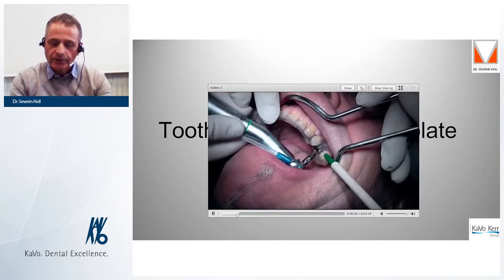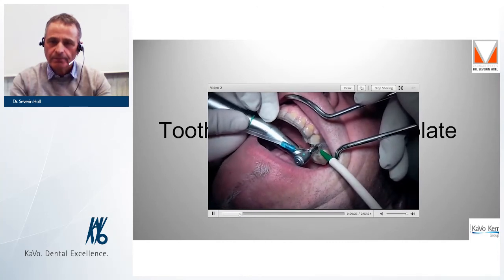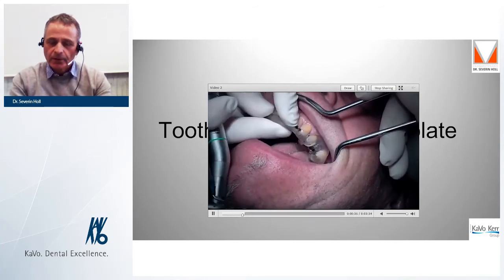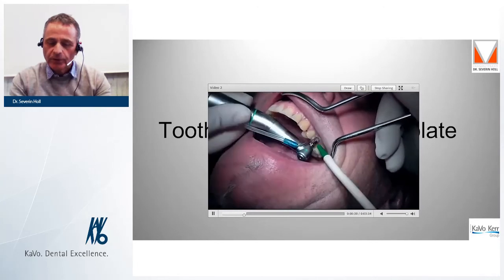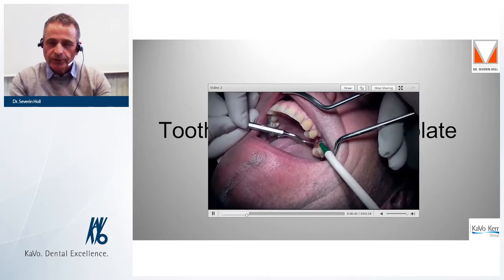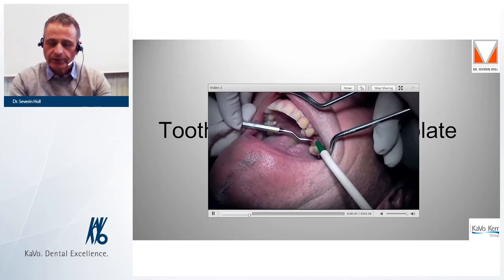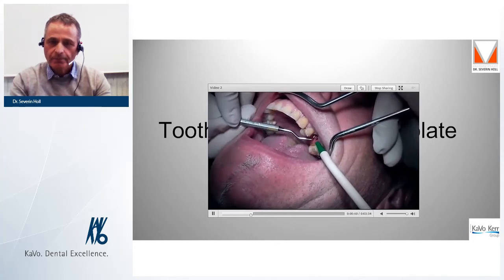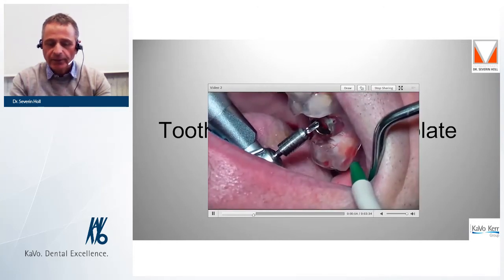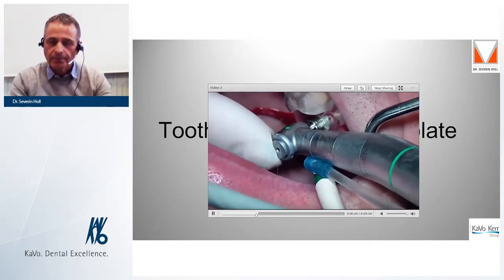After that, we start with the gingiva punch. To detach the gingiva from the bone, we take the template off again, rework the punch and remove the gingiva with a sharp spoon. We put the template back and pierce the cortical bone with the initial drill.